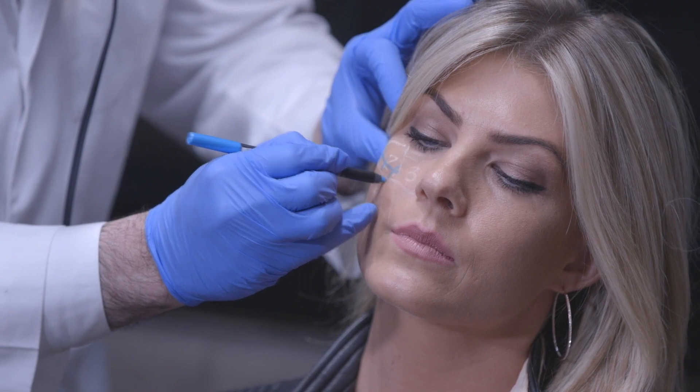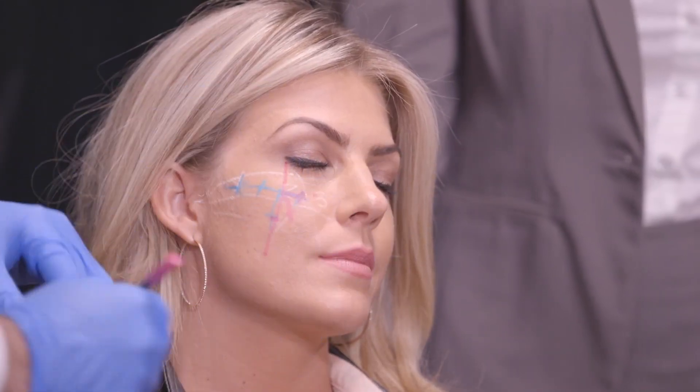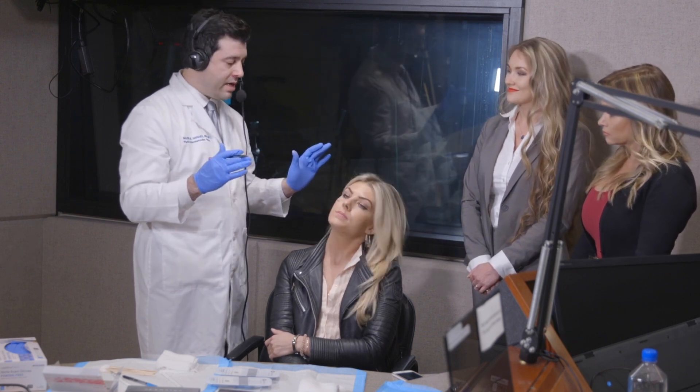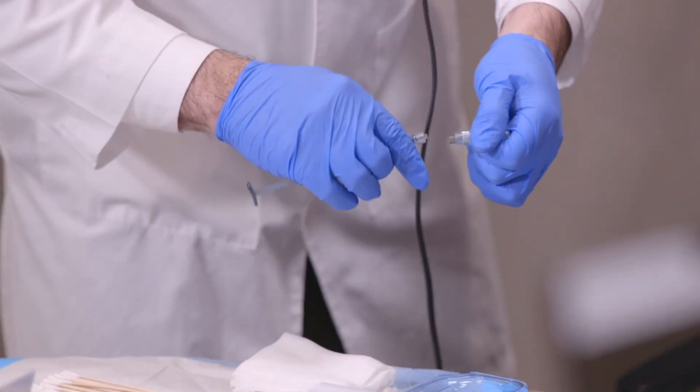Dr. Haraki is marking the patient in preparation for the facial injection. The product has lidocaine in it — it's safe, you don't need any numbing cream or prior numbing injection. All these spots are close to the bone where we put the product. It's safe, away from nerves, away from any neurovascular blood supply, and away from potential injuries to anything in the surrounding area. It's very safe and methodical, and the goal is to look rejuvenated and fresh, not augmented. The plan is to inject the entire right side, wipe it, and compare that filled right side to the unfilled left side so you can see them side by side.